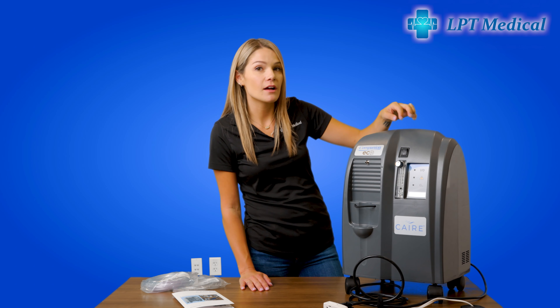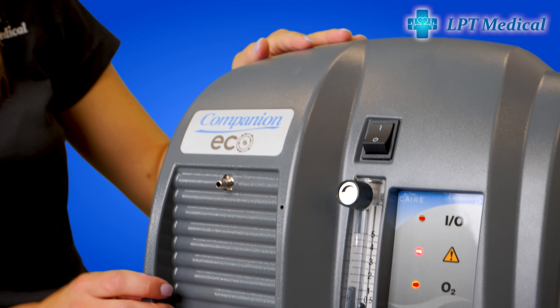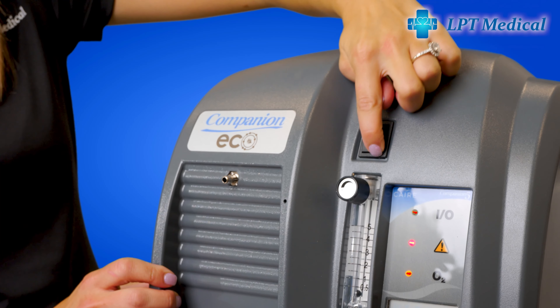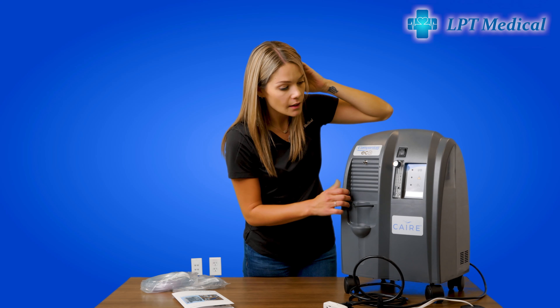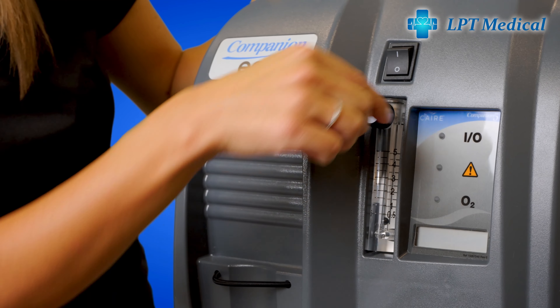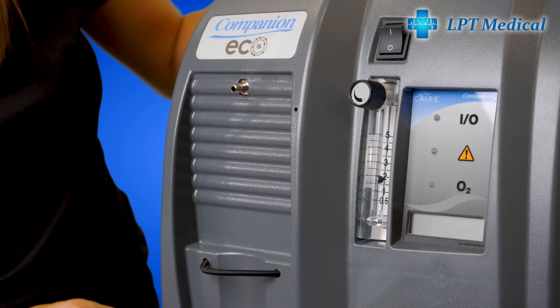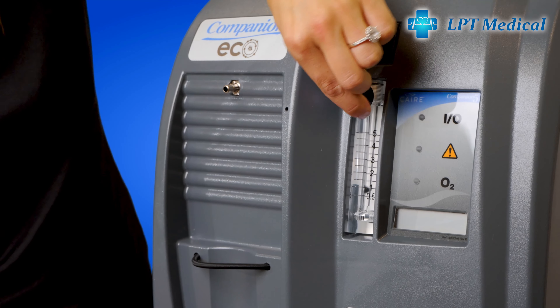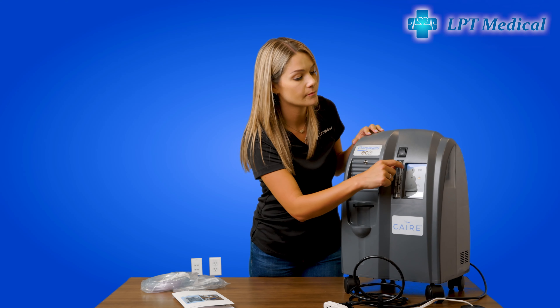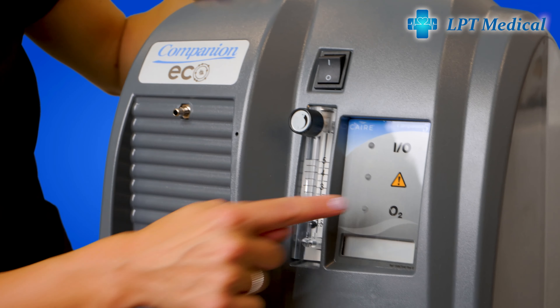To power on your Care Companion 5, simply flip the switch. To turn it off, just push the switch back down. The oxygen concentrator does 0.5 to 5 liters per minute on a continuous flow setting only. To adjust your setting, just turn this knob — wherever the ball lands is what liter flow you are on.